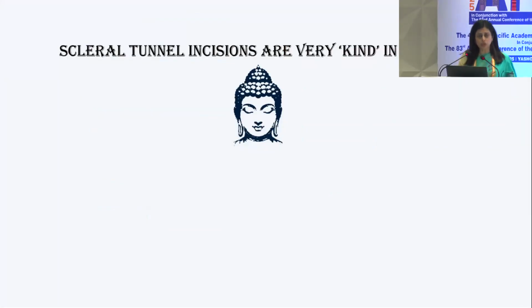So these two examples show us that when the patient did not have any pre-existing astigmatism, the patient underwent customized incision cataract surgery and there was no induced SIA. In the second patient we saw higher astigmatism, the patient underwent customized incision cataract surgery and that was treated with the scleral wound modulation.